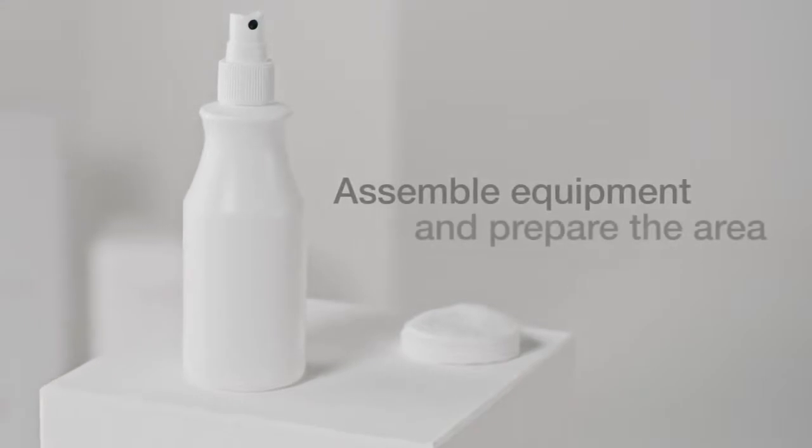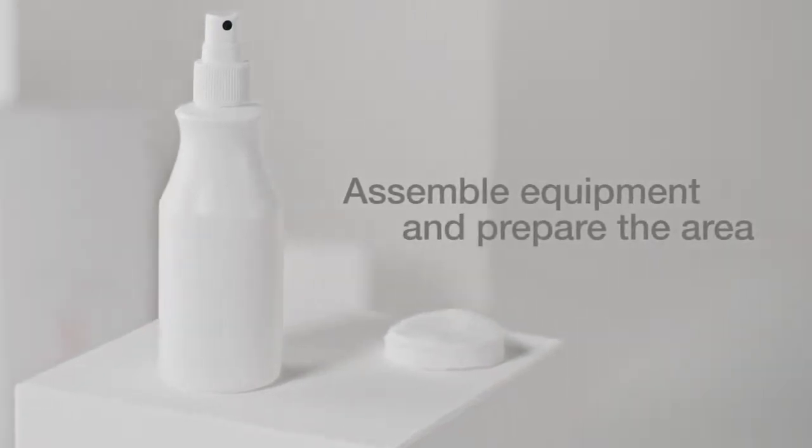Okay, let's go. Assemble all equipment and prepare the area.